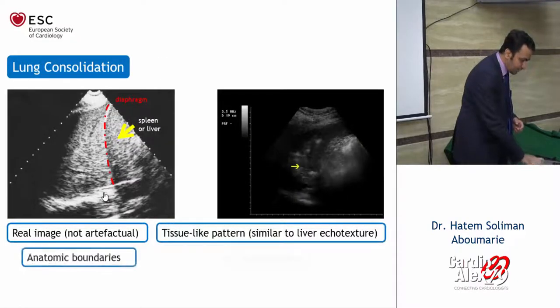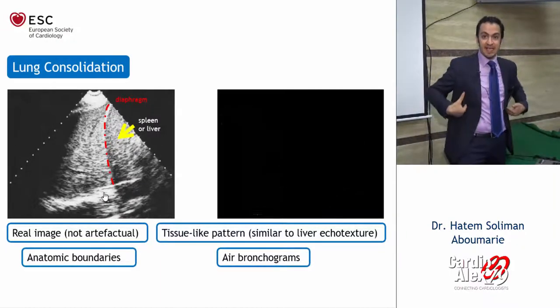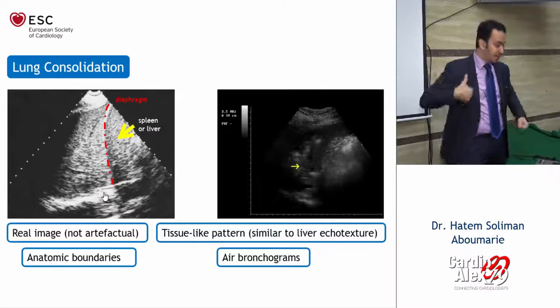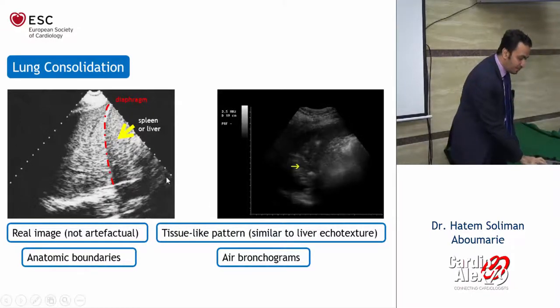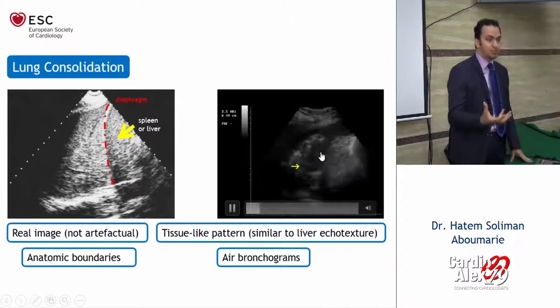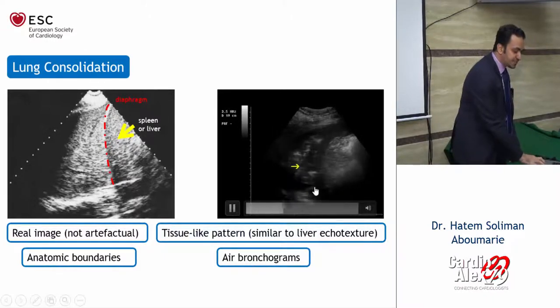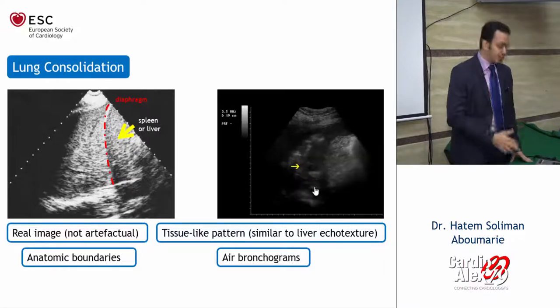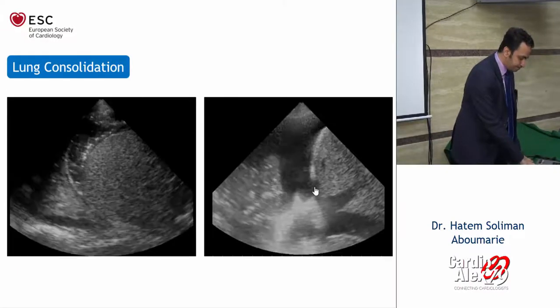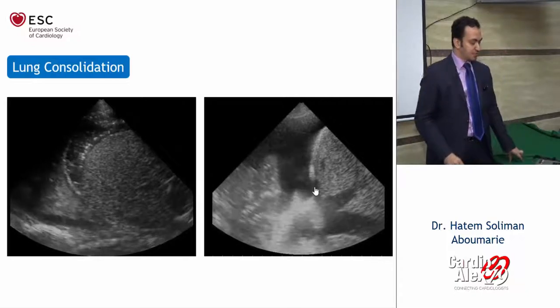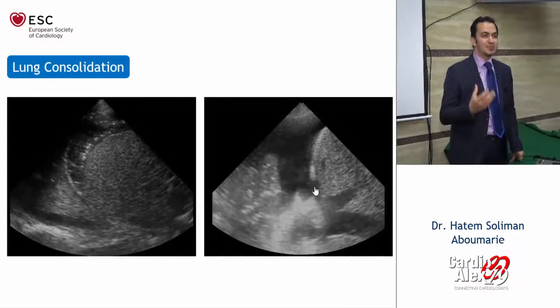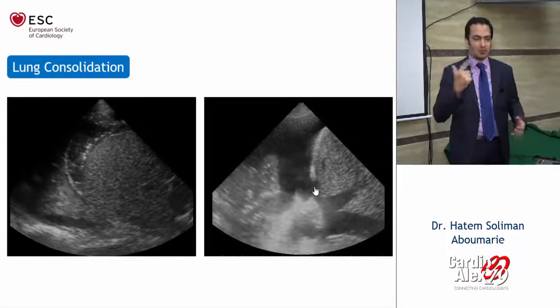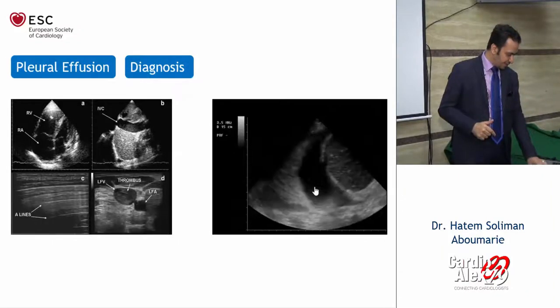This is a characteristic comparison: hydrostatic pulmonary edema shows B-lines with a thin healthy pleura, while the other patient shows B-lines with an irregular shaggy pleural line and clearly visible sub-pleural consolidation — very specific for pneumonia. In ARDS and pneumonia we see consolidation, while in heart failure and hydrostatic edema we mainly see pleural effusion, predominantly on the right side, without consolidation. Looking at the costophrenic angle, using the diaphragm as landmark, above the liver you see a hyperechoic heterogeneous tissue-like structure with air bronchograms inside — very important and specific for consolidation progressing to ARDS. Lung ultrasound shows what X-ray cannot — consolidation versus atelectasis versus pleural effusion.